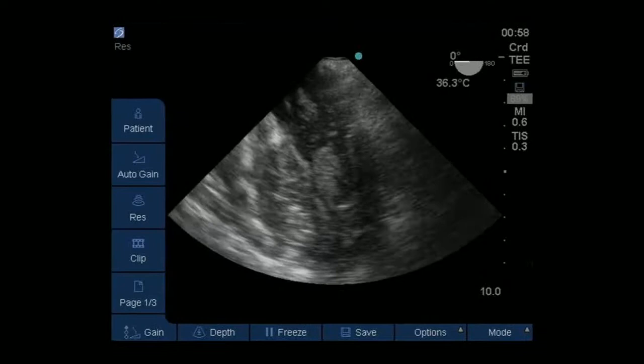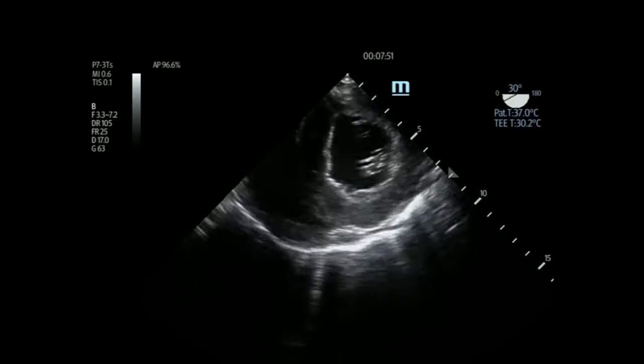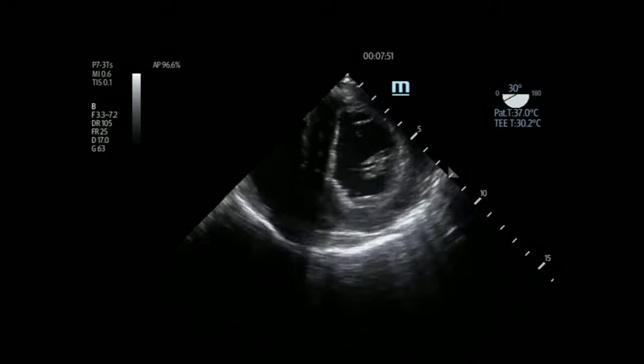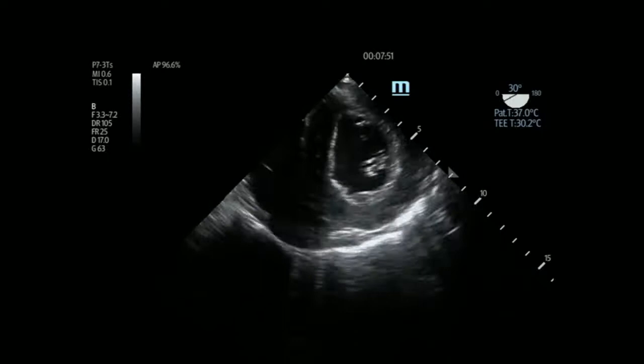If you push the probe down the esophagus to the end of the stomach, you get a short axis view. Again, really easy to figure out what's going on. There's the right ventricle, there's the septum—it's easy to see the septum's not moving. If you're used to doing TTEs, it's not hard to tell what's what.